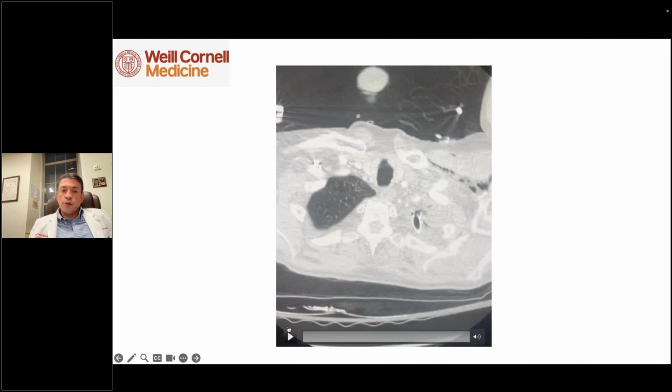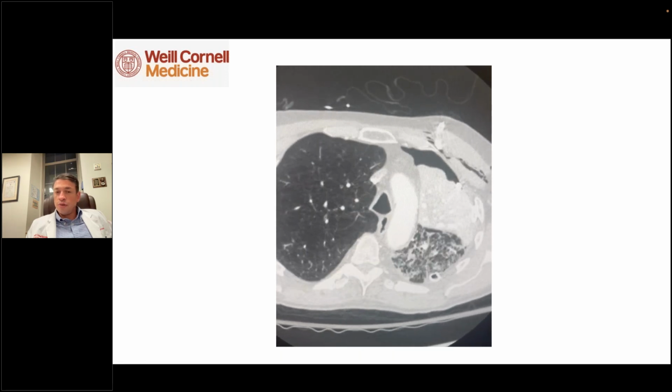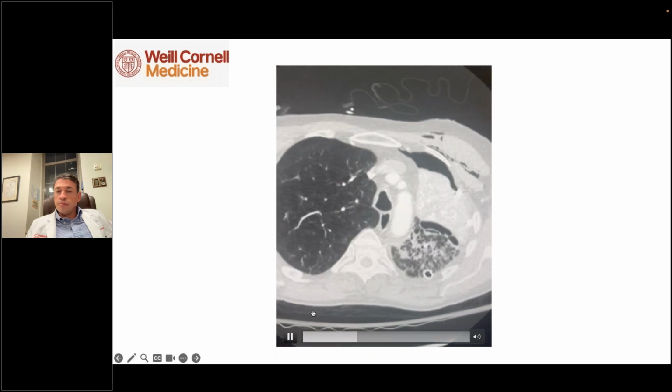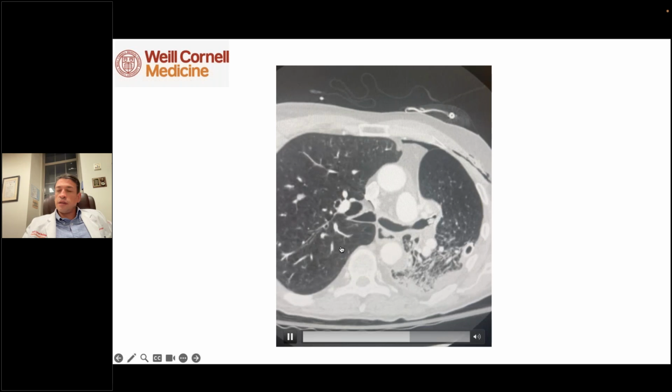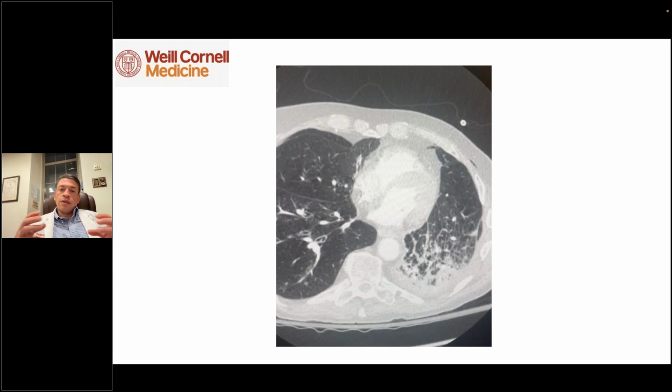I want to show you an example of a patient who, at least to me, served as an example and made me appreciate better some of the problems you can encounter related to a space issue. This is a patient who had a left upper lobe valve procedure. There is obviously a chest tube in place. He's having a really bad leak. Left upper lobe is completely closed. You can see that he has a space because his remaining left lower lobe could not fill it. He also aspirated on top of that, so he was on high flow at this point.